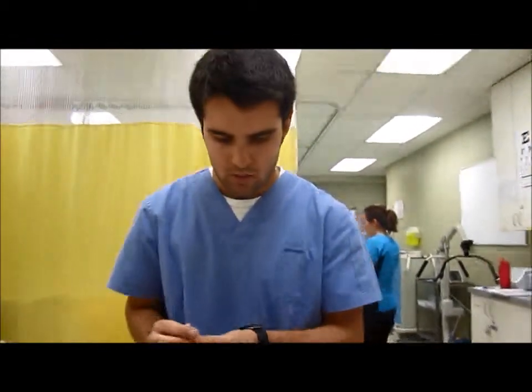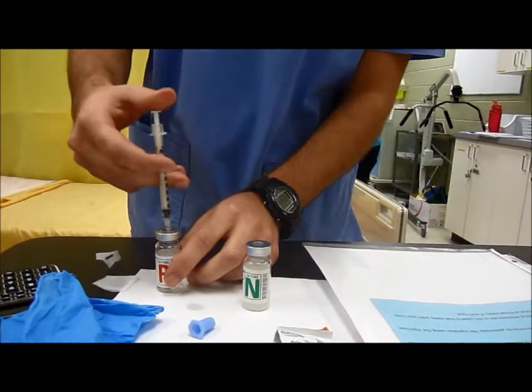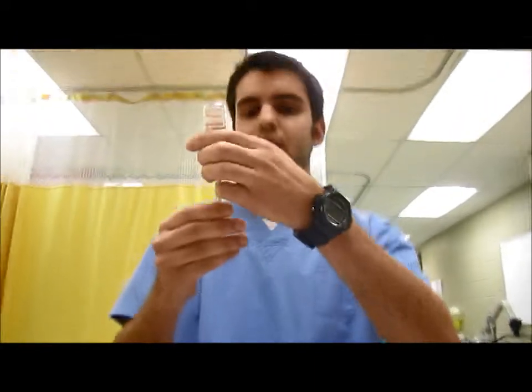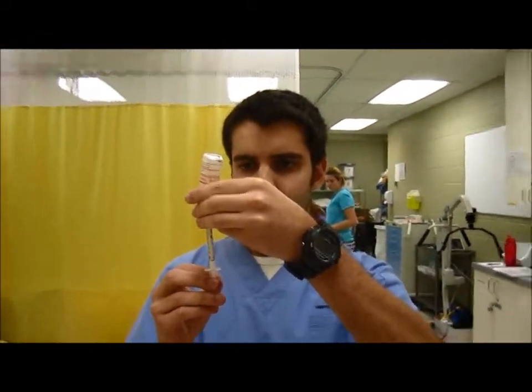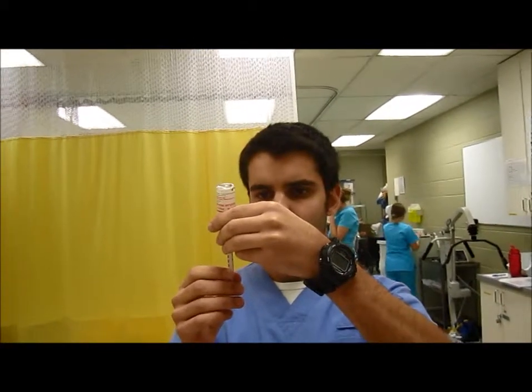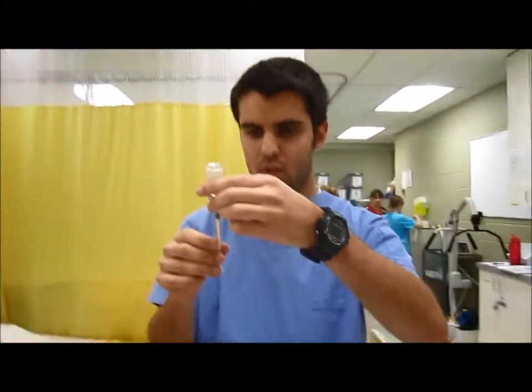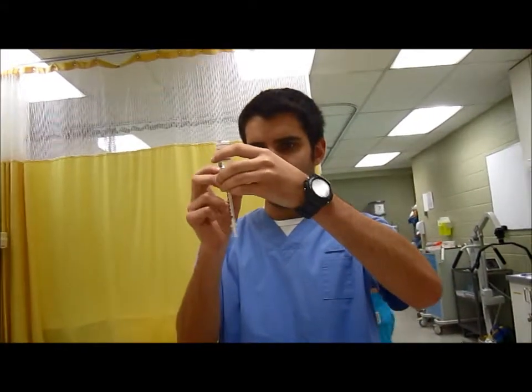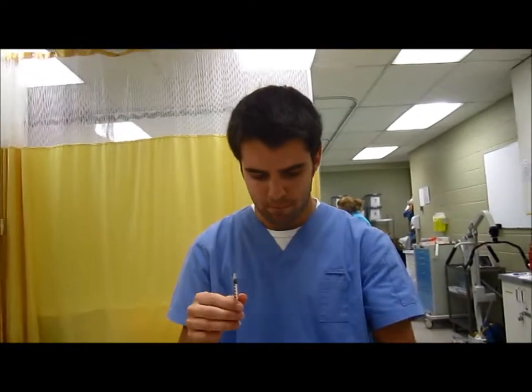The top has already been swabbed. Inject that in, and then go like this and pour it out. So there's 4 units of regular insulin going into there. There's just one tiny air bubble. Okay.